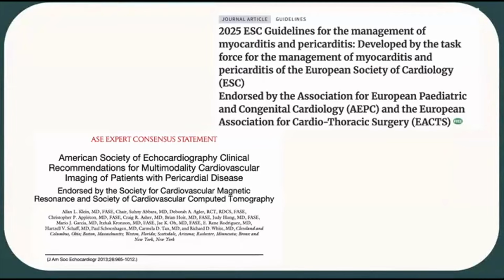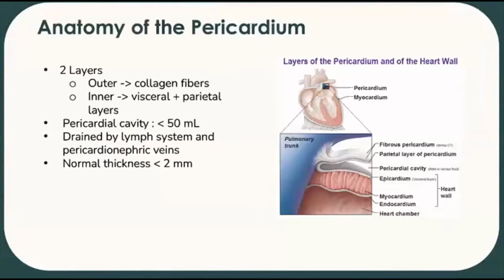So the 2025 most recent guidelines on myocarditis and pericarditis, obviously I really just focused on the pericarditis piece today, as well as the ASE recommendations for the specific echo features for the same. Those are from 2013. So we'll touch on the anatomy of the pericardium.